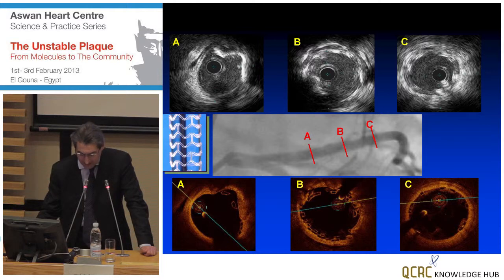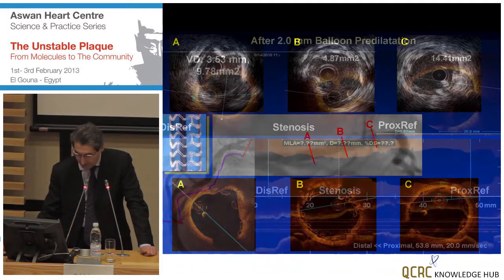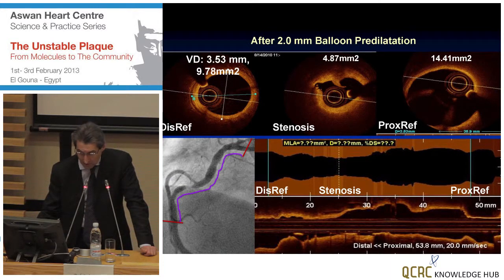So the superiority of OCT for the assessment of thin coverage of drug-eluting stent or apposition or any stents, and in particular of these devices that has been shown disappears much more efficiently when they are properly in contact with the vessel wall, is far superior with the optical coherence tomography. The other advantage of optical coherence tomography is that there is such a sharp delineation of the lumen wall interface, even when they have a complex wall interface, such as after balloon dilatation.